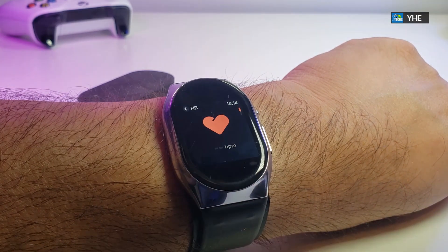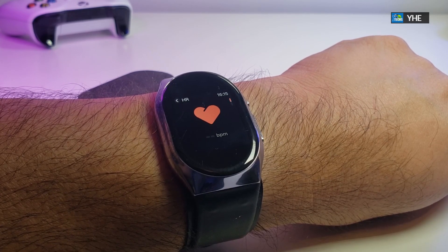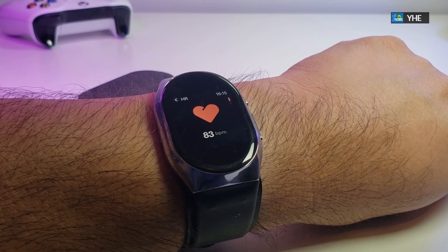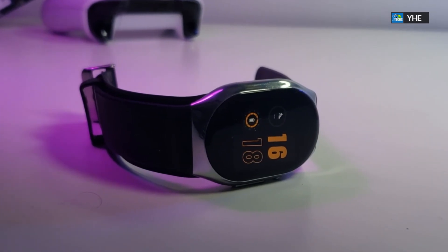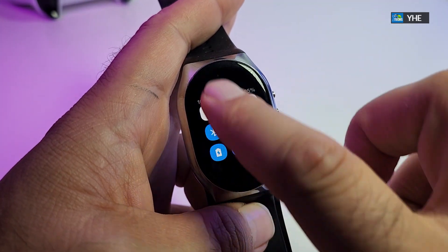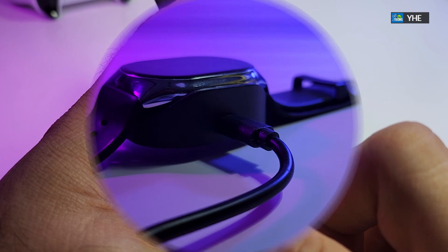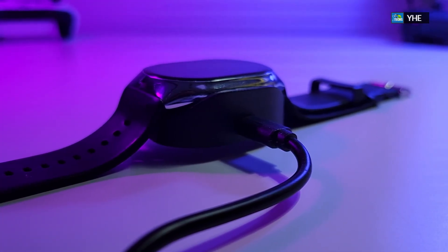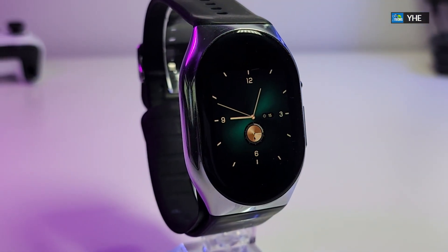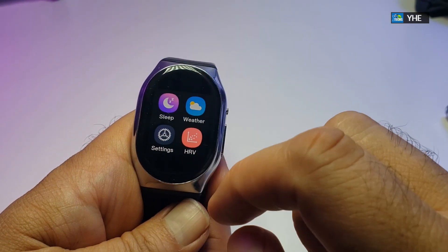Now let's switch to the heartbeat monitor. This is really useful if you want to go running or see exactly how fast your heartbeat is. It takes a little bit to process but it does work perfectly. Before we move on, this watch has no NFC, GPS, or Wi-Fi — it only runs on Bluetooth to get your heartbeat and blood pressure. The battery is about 180 milliamps, which should last roughly about five days. It runs on Bluetooth 4.0 only, and the resolution is 320 by 360, but it works perfectly.